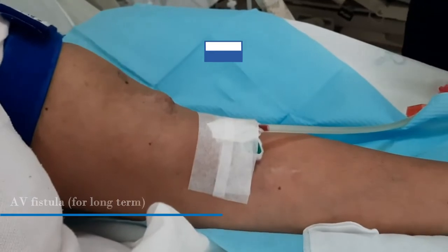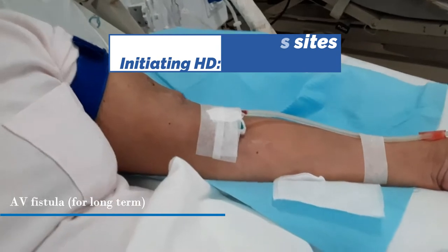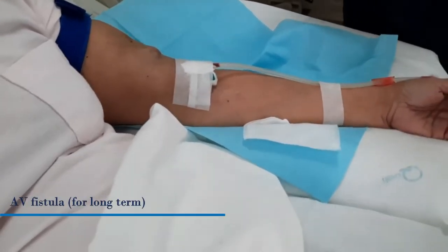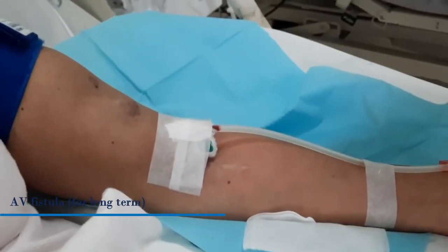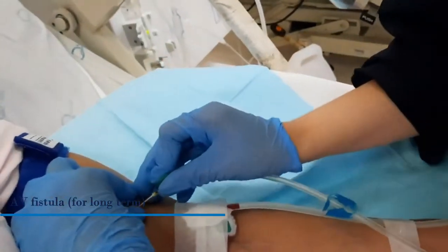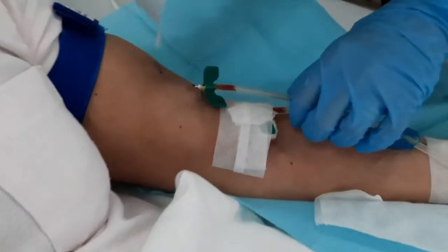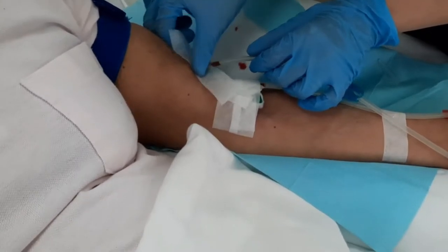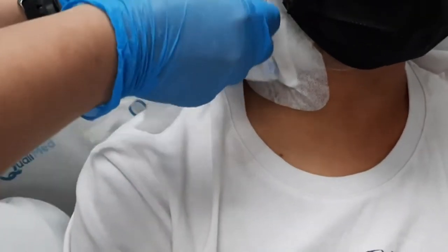This video shows an HD nurse starting the dialysis by cannulating the AV fistula of the dialysis patient. Can you see that? It's very cool. So for AV fistula, it's actually the best choice for access. If you are eligible, it's the most natural access site since it's formed from your own blood vessels.